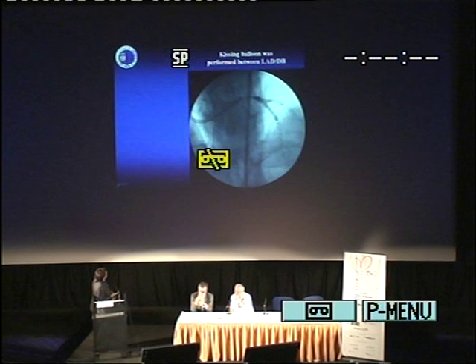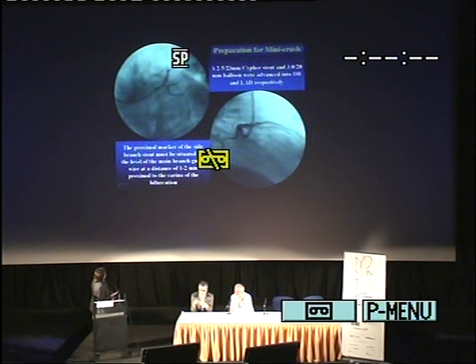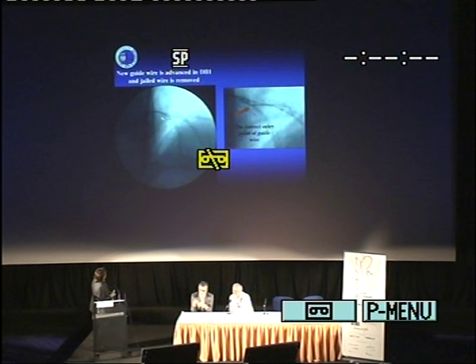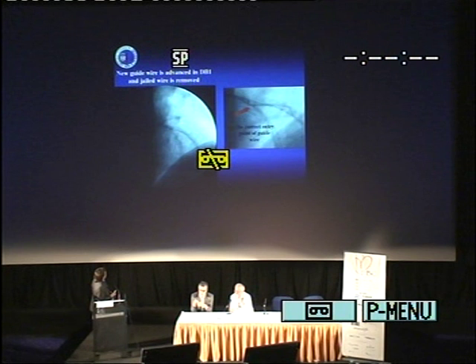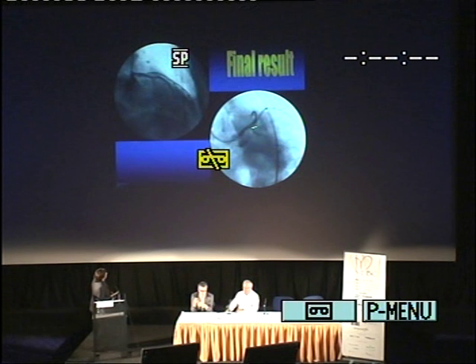Now we have this problem here — remember that the stent is from here to here, not here, so that place has not been treated. So we decided to do a mini-crush again. We implant the stent, crush with the balloon, assess in two projections the beginning — the marker should be on the line of the main branch stent — then crush with the balloon, insert the stent, leave the wire behind the stent, insert the second wire, and at the end the kissing balloon. Here is the result showing that even though there is quite a big round curve of this vessel, the opening of the strut is excellent.